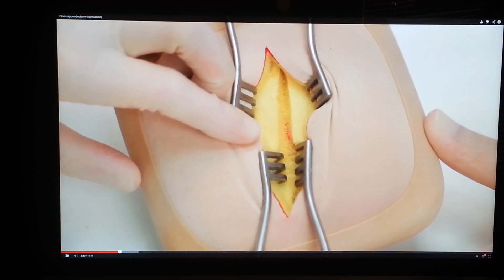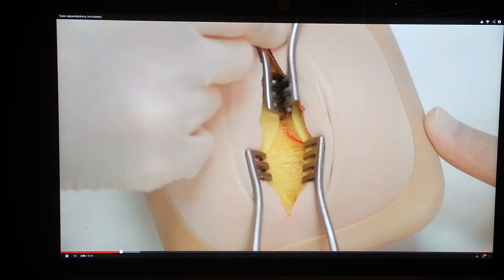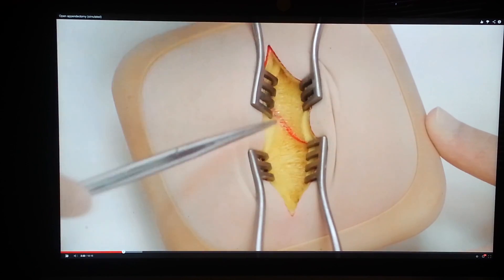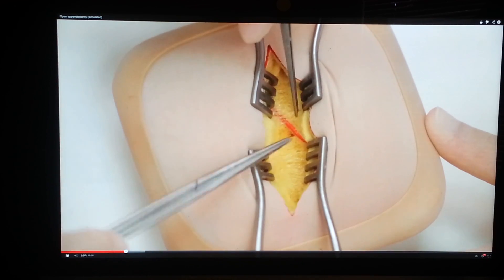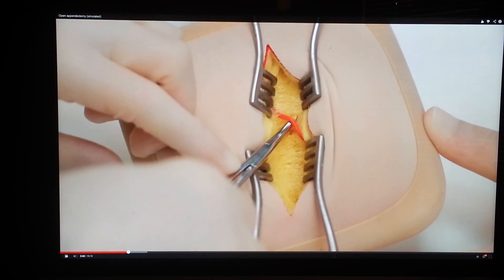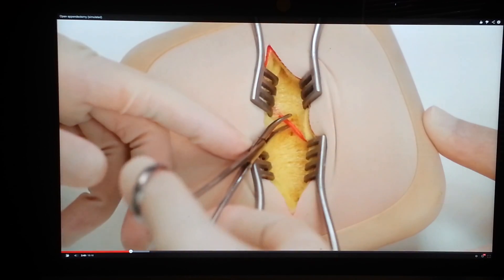Self-retaining retractors should be repositioned to give a better view. Blood vessels crossing the operative field should be ligated with a suitable material such as 3-0 Vicryl. Spreading dissecting scissors along the line of the blood vessel is less likely to damage it.